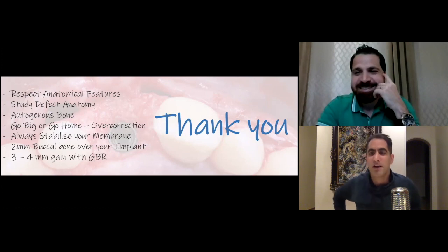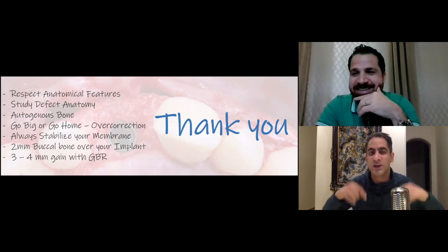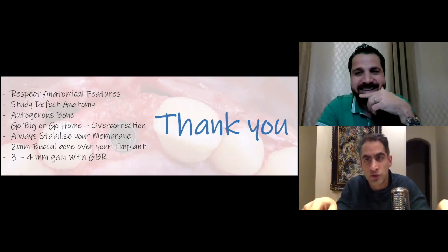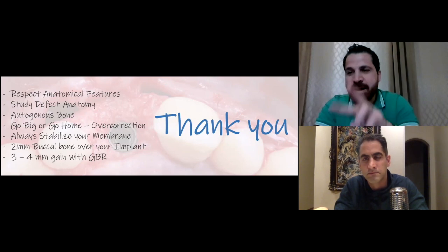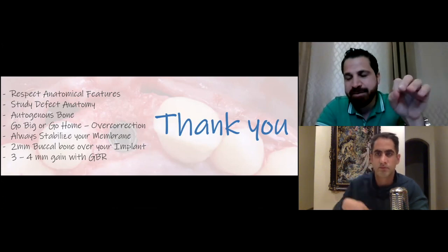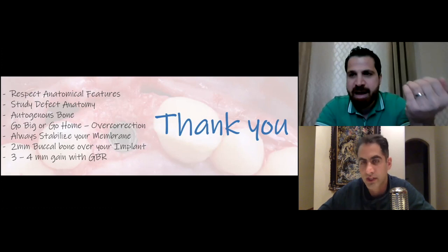My final question, I don't want to take more of your time because your topic is super interesting and we can talk about it for hours. I just want to know your recommendation regarding choosing the screws. Do you have any preference for the diameter of the screws that you're using? In the two cases, you will see two different kinds of screws. The first one is 1.4 millimeter with a small head. The second one is 1.2 millimeter with a large head. My preference is a large head and 1.2.